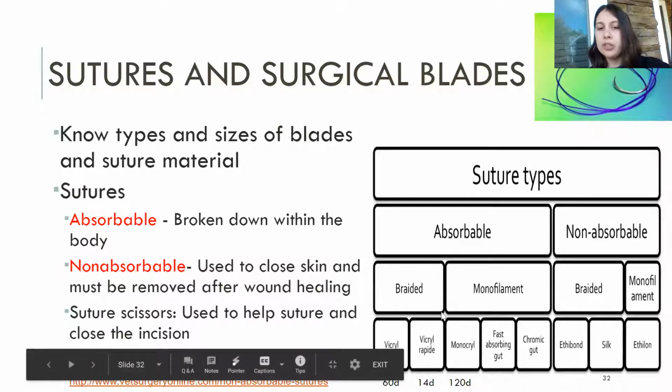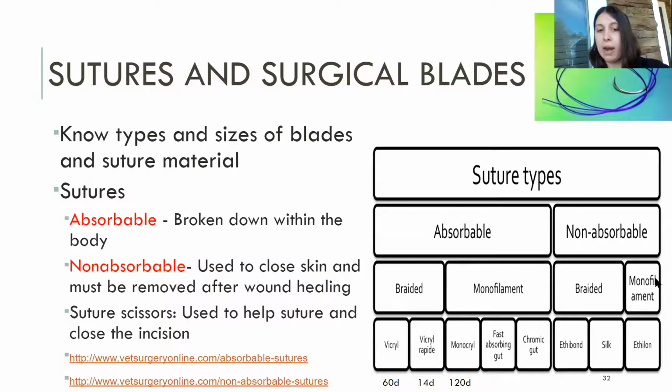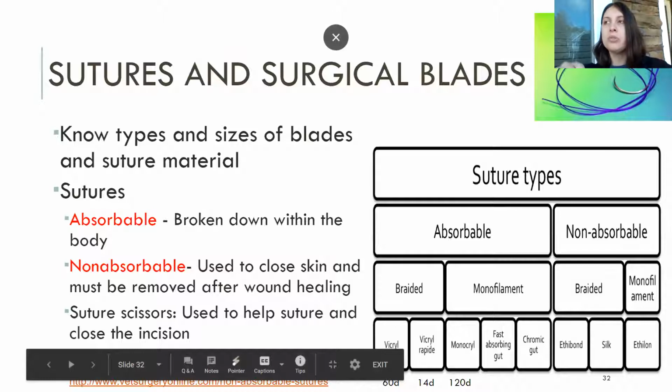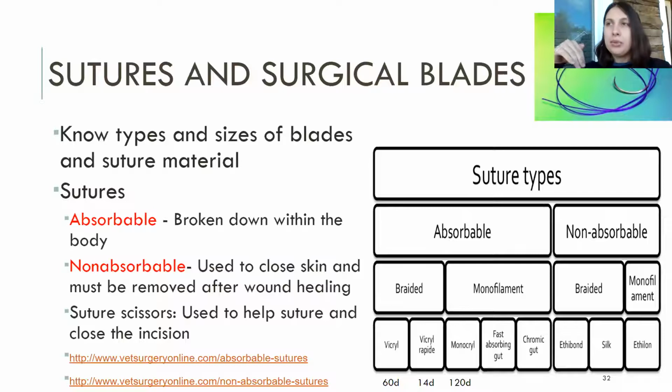Absorbable sutures, depending on what type you end up using, can last different amounts of time. The Vicryl Rapid is going to be in the process of being absorbed after 2 weeks of being put in, whereas the Monocryl is going to last about 4 months. The absorbable ones get broken down and start losing the strength to really hold things together about midway through their life.